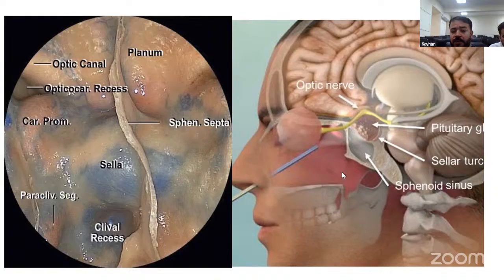get our anatomical orientation by going inside the septectomy or the sphenoidotomy. This is one of the markers that we are in the midline. But sometimes if we are facing problems, we can also check a lateral view X-ray of the sphenoid sinus, to see whether we are in the center or not, if there is any obligation for the neurosurgeon.